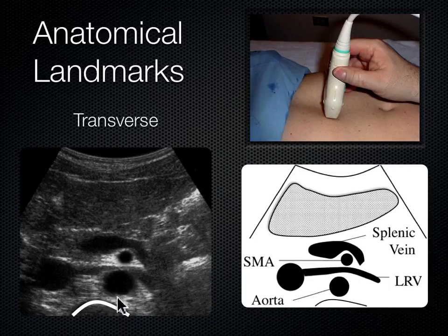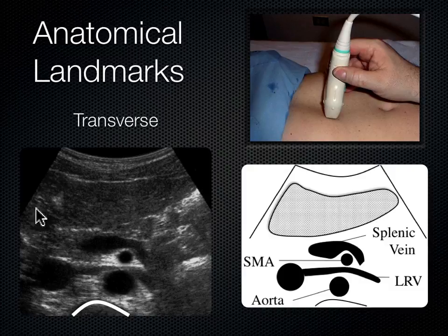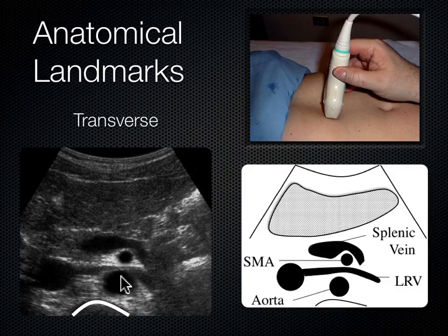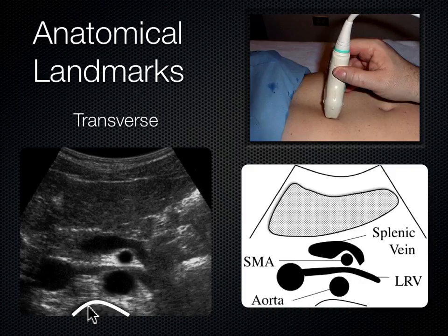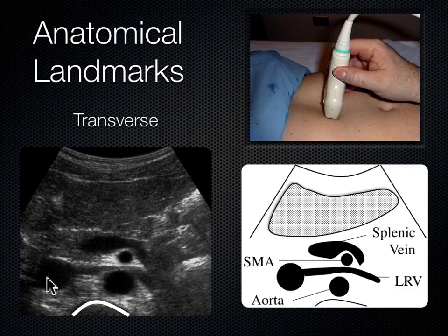Moving anterior from the spine shadow: in a transverse view, everything on the indicator side is to the patient's right — as if you're standing below the patient's feet looking up into their body. The vessel to the left of the spine shadow is the aorta, clearly seen in the diagram. And to the right of the spine shadow is the IVC.